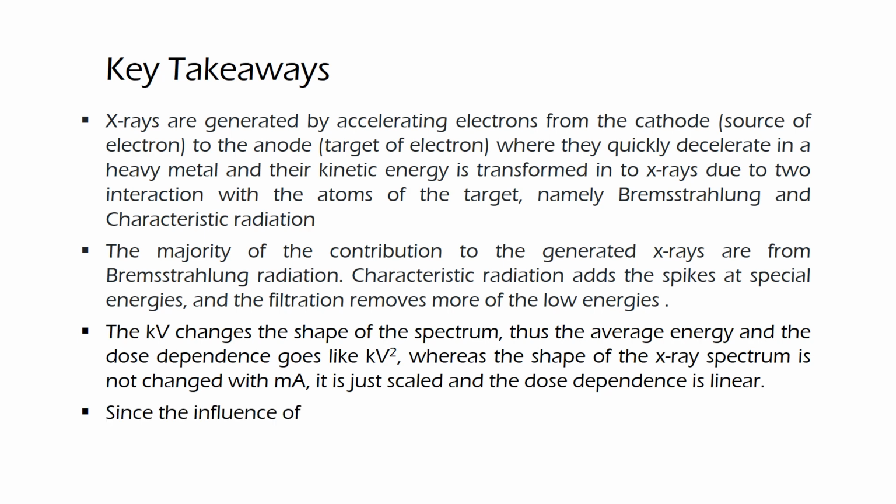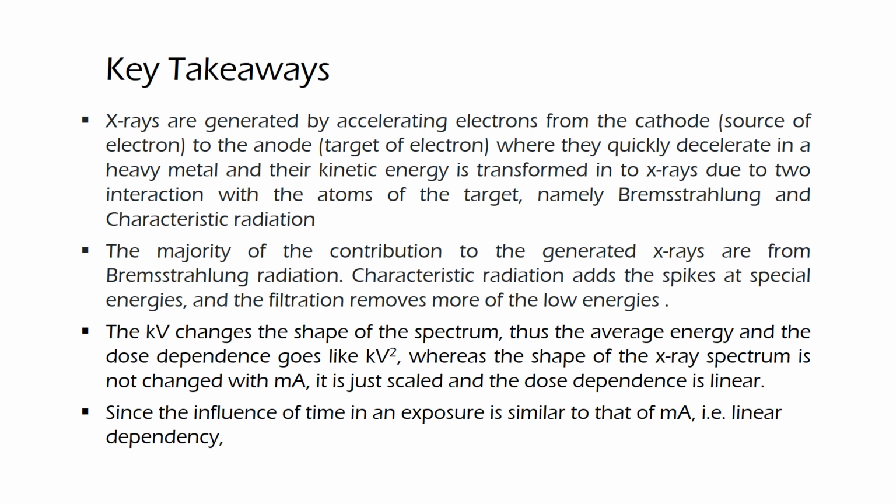Since the influence of time in an exposure is similar to that of MA, that is, linear dependency, recent exposure techniques use time-integrated MA or MAS.